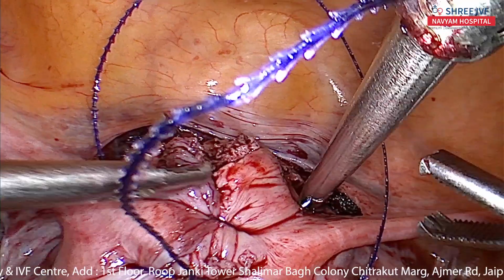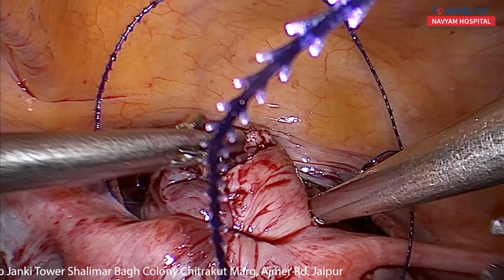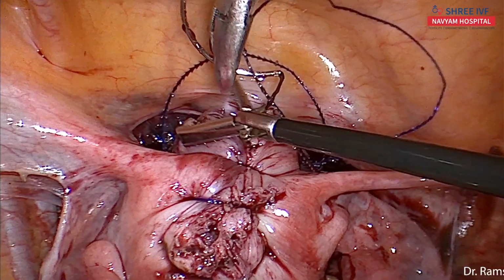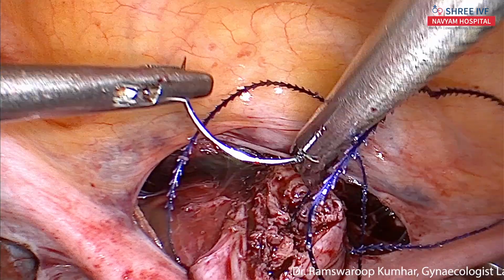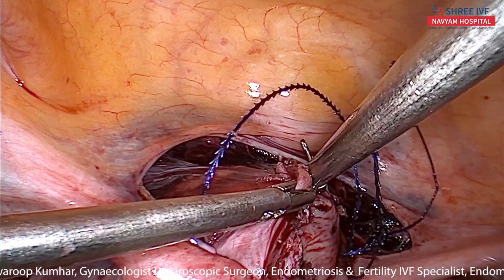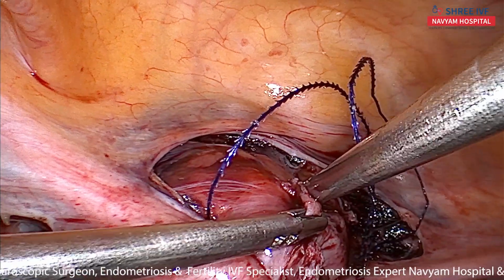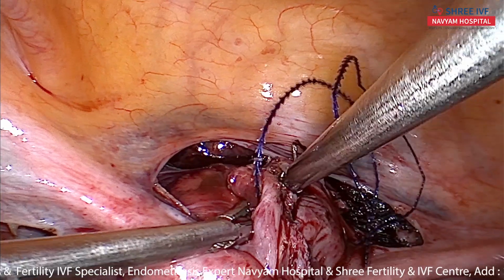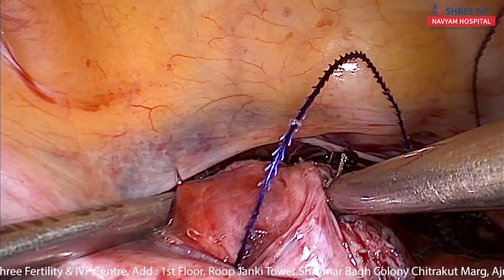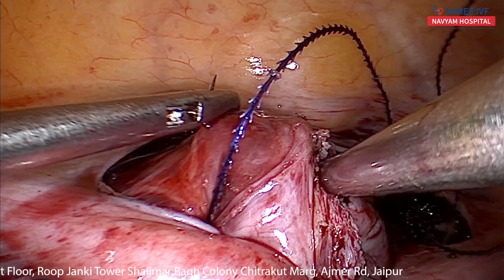This is a deep bite, and I'm taking one by one on both sides for proper depth to obliterate the dead space completely. And because this side the fibers were very deep. Okay.